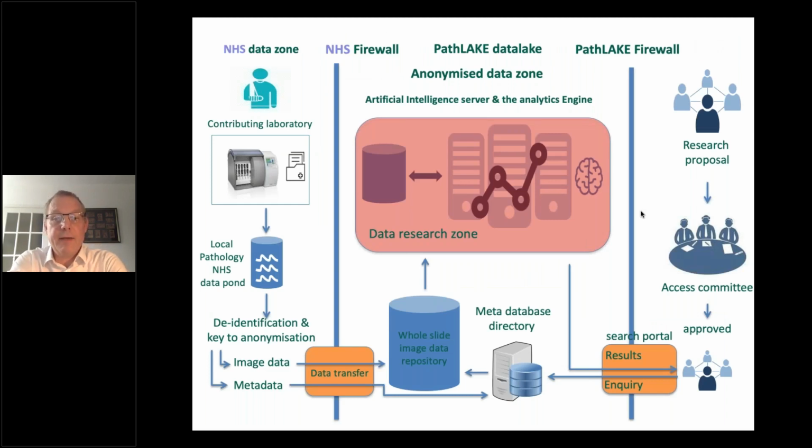To enable this to happen, one of PathLAKE's primary objectives, as mentioned, was the formation of a data lake. This is collated from cases from each of the institutions that are part of PathLAKE, feeding whole slide image data into the data lake, along, of course, with the clinical metadata that's so important to make sense of those slides. We house this data in a secure area at the University of Warwick Computer Server Hall, where it can be accessed by parties given approval.